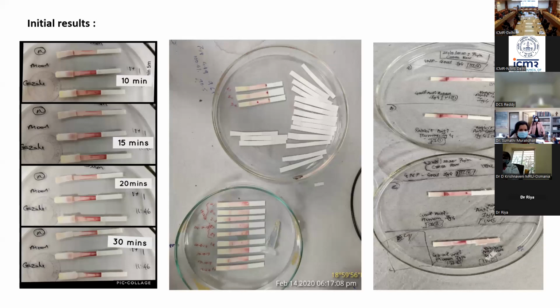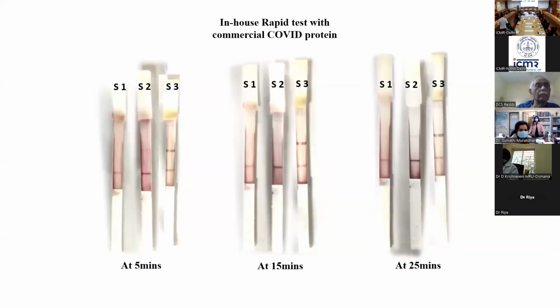Now, this is how it looks. It doesn't look all grand in your academic institute. So you do it in a petri plate. You do it in a very cheap way. That is, you do not draw lines. You use the pipette and you put dots, as simple as that, so that the antibodies are not wasted. When you get good results over here, you move to the next step, which is the line. That also looks like this.